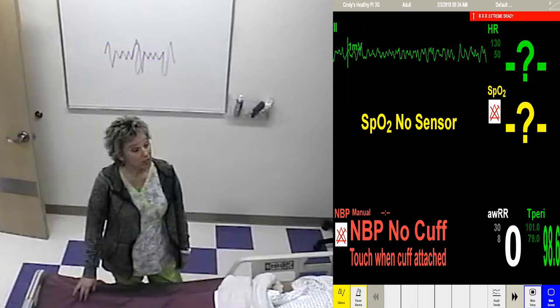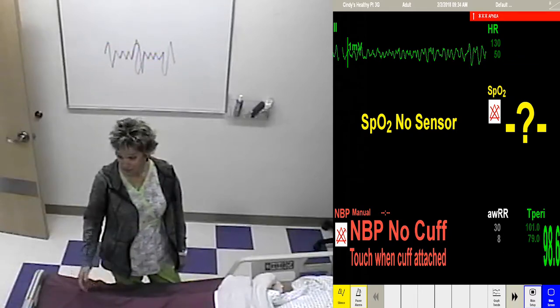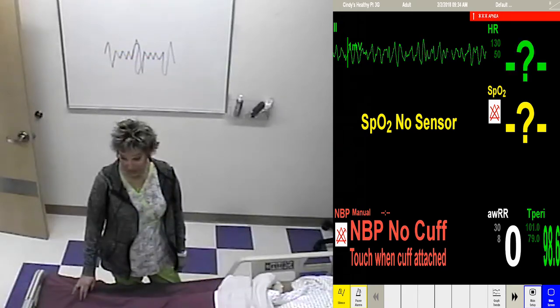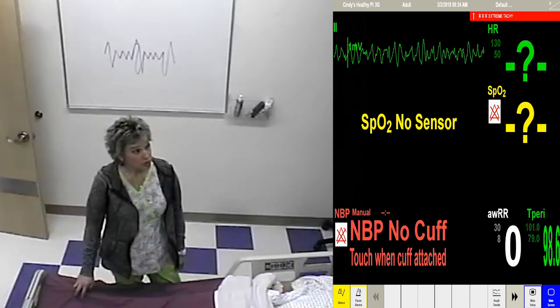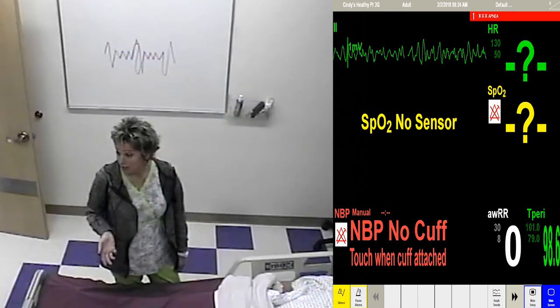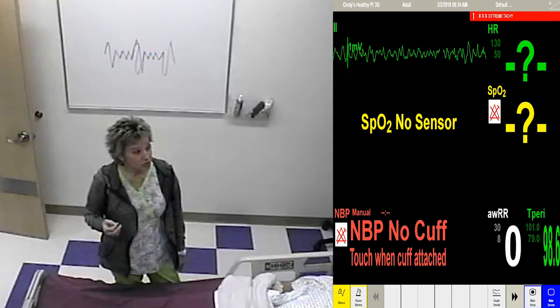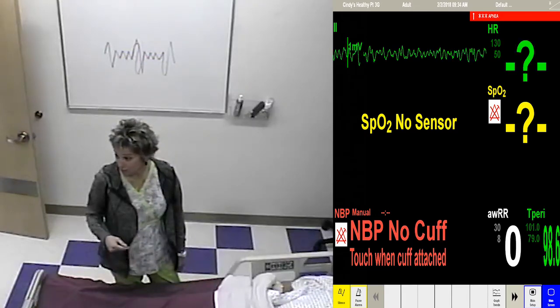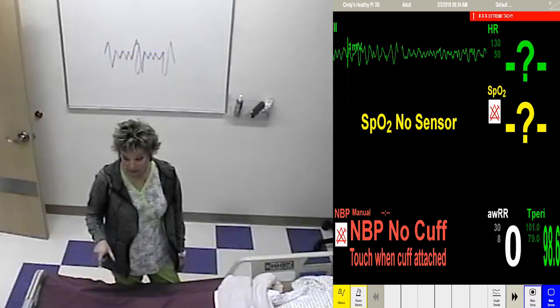Asystole? It's not asystole, although it does sound like asystole. So, did you answer yes to all the questions? No. So is there any way this is sinus? No. So those up and down things that you see are some QRSs. So if there are QRSs, what's the first word going to be?